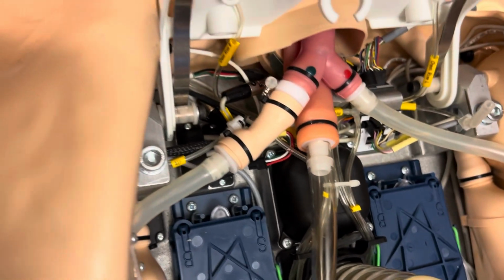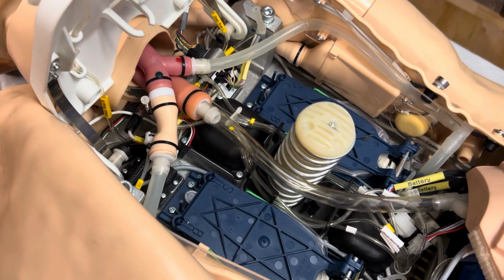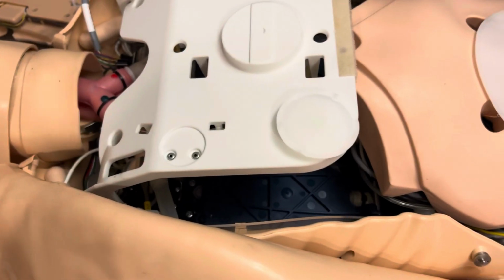Now we're going to make our connections, and then do everything in reverse by putting the chest assembly down and the chest plate back on. Make sure you make your connection. Abdominal assembly goes back in place, and then peel the skin back over.